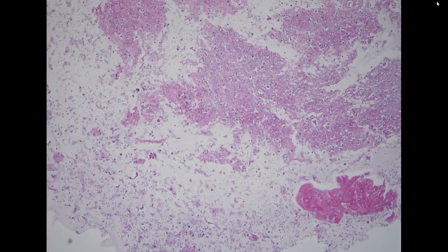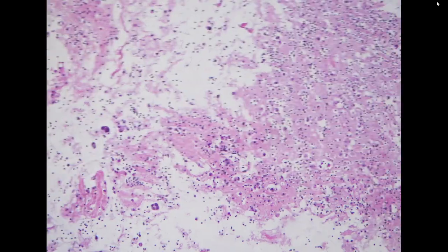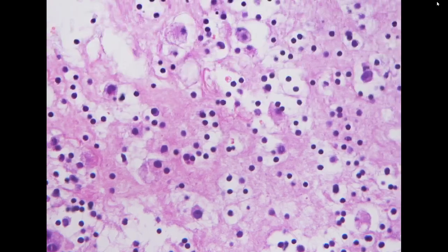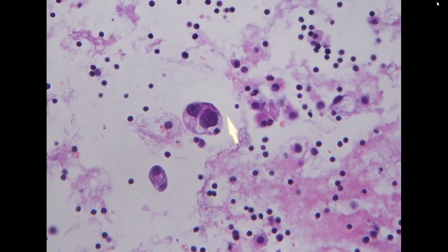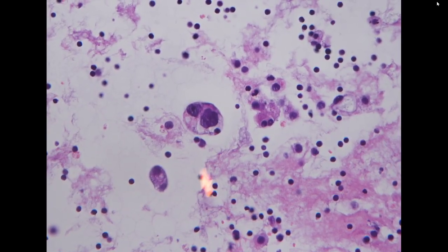And if you check the cell block preparation again, the lesional cells are scant. Here you see the majority of these cells should be histiocytes. But from here to there, you can definitely see a cluster of glandular cells with marked atypia, and this is adenocarcinoma. So the cells are not so many, but still diagnostic.